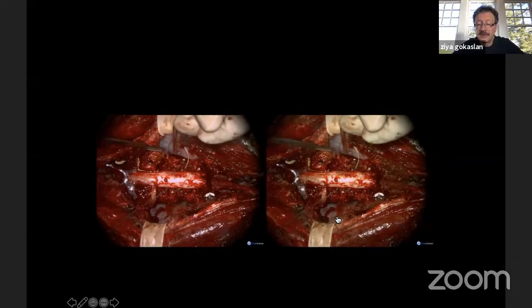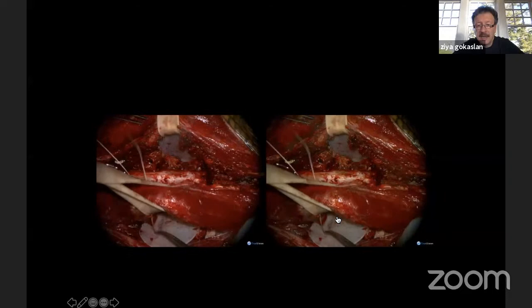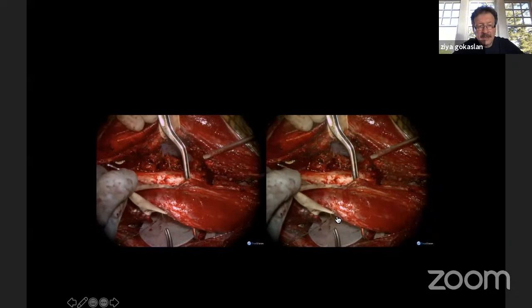And so after this is done, we typically put at least one of the rods in place temporarily to stabilize the spine. And then the rod will be used in order to attach the pulley. And these wires are going to be pulled through the pulley. You can see the far side of the spinal musculature is in the Penrose drain, and it can be manipulated medially or laterally when you're passing the wire, as well as when you are putting it through the pulley.